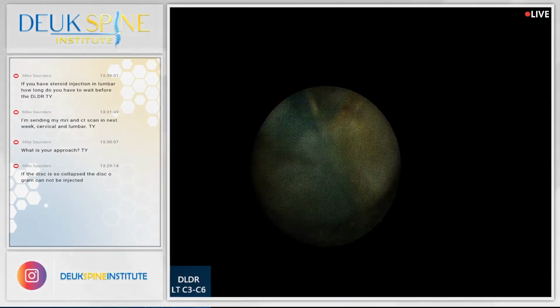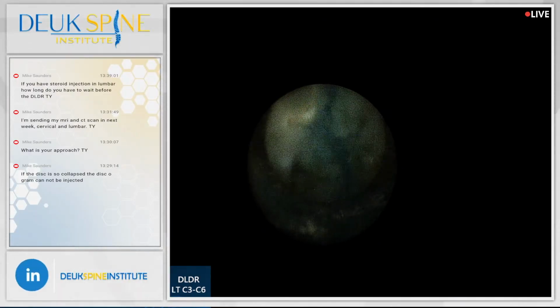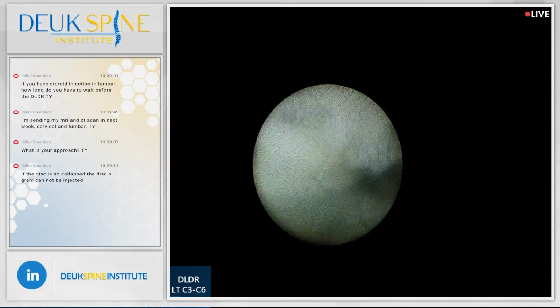See if you can ramp it up a little bit more. I just don't understand why.